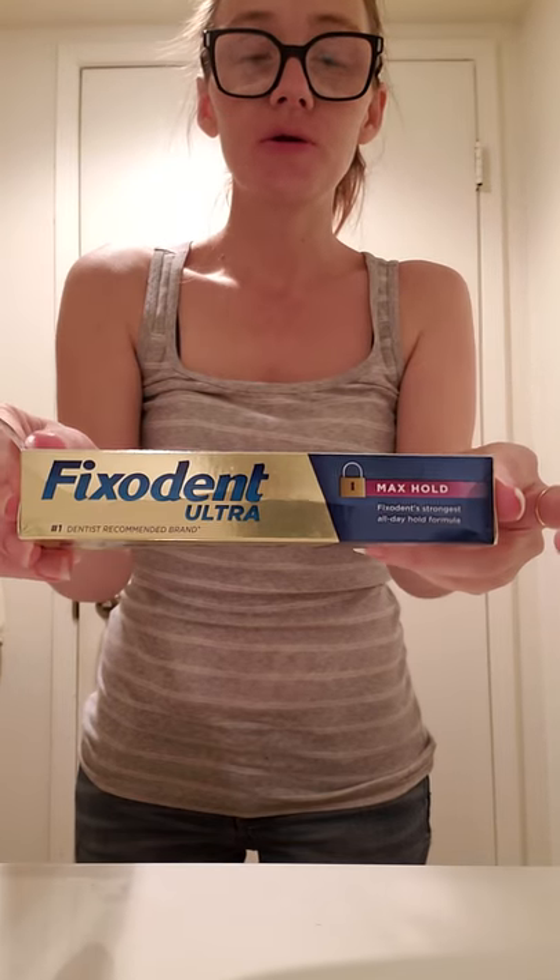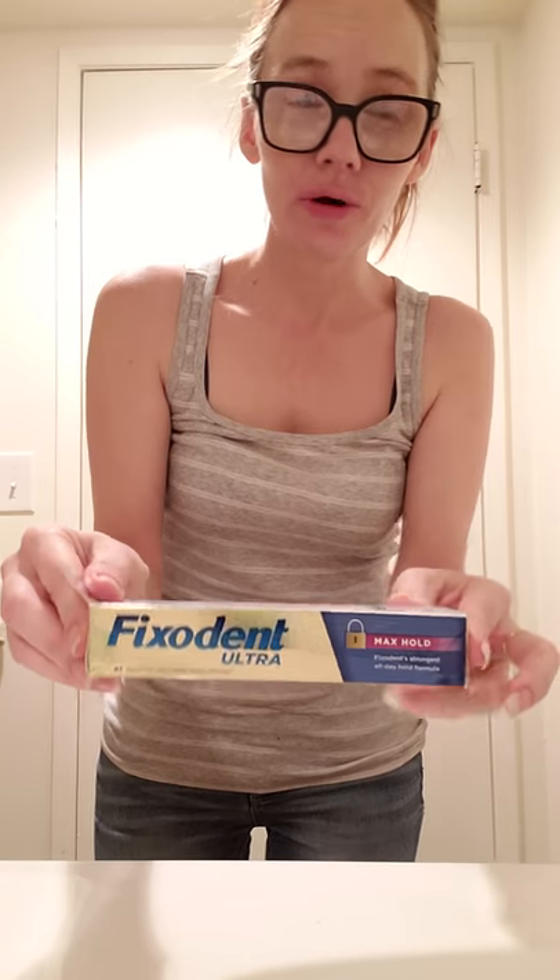There it is — I applied it here, here, and here. That crap holds really, really well. I just wanted to show everyone what I have to do to get it out. This stuff is no joke — less is more with this product. I haven't used the other products yet; I'm trying to give this a full week. I can't put them in with suction anymore — my gums have changed — but it's working great.